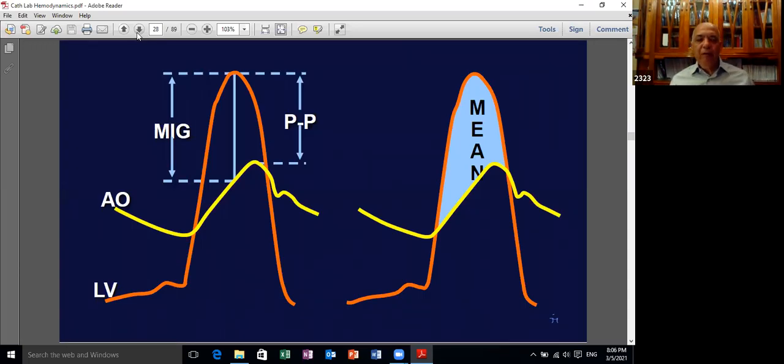So we move from that to the pressure tracings, which we take in patients with stenotic valves. We know that there is a difference between the pressure tracing taken in the echo lab and the pressure tracing taken in the hemodynamic or the cardiac catheterization lab. Although we often take the mean pressure in both of them and they are equivalent, in the cath lab we measure the peak to peak pressure, and this is an artificial pressure.